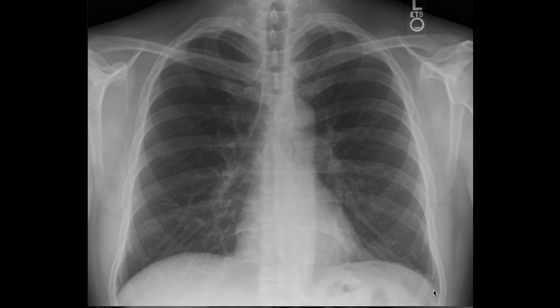So here we have the dome of the diaphragm. This is the left dome of the diaphragm. This is the right dome of the diaphragm. And cost is pertaining to the rib. So this is the costophrenic angle. This is inferiorly, and then laterally you have to include the wall, like the chest wall. This is a chest X-ray, so indications.